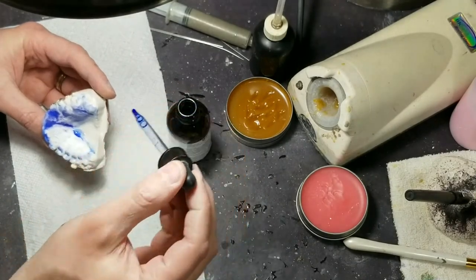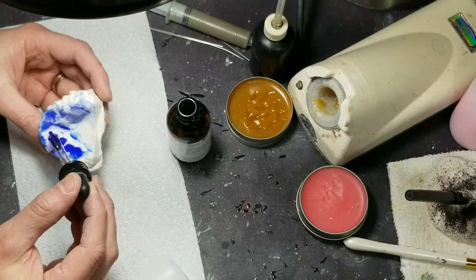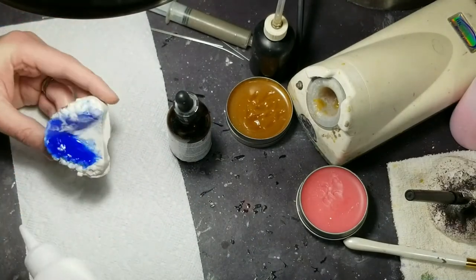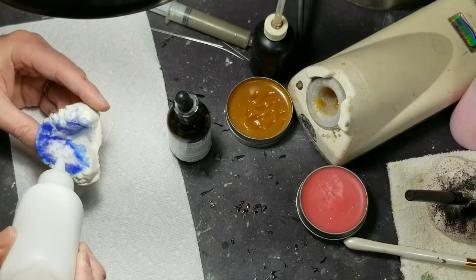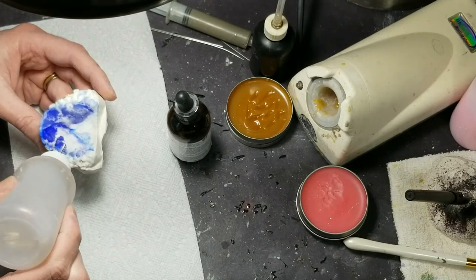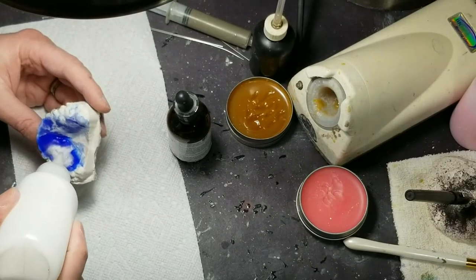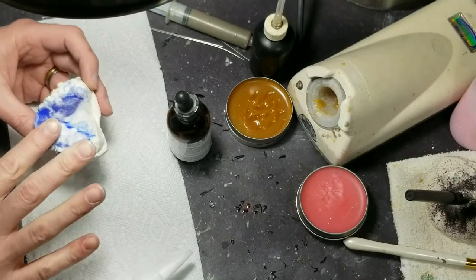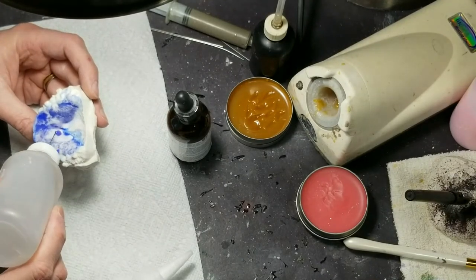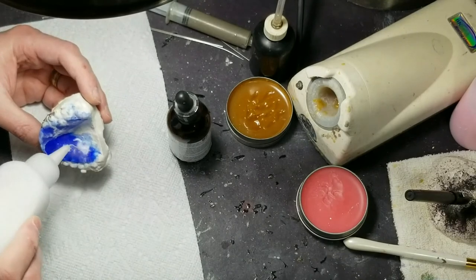This blue really shows up in this light — I really like it. It's called cobalt blue, it's from JBC. You can see now where I sprinkled the powder how the monomer is soaking it up. I like mixing colors — that's how I get my maroon. In Texas we have Texas A&M — their colors are maroon and white — so I get a lot of those requests, and burnt orange too.